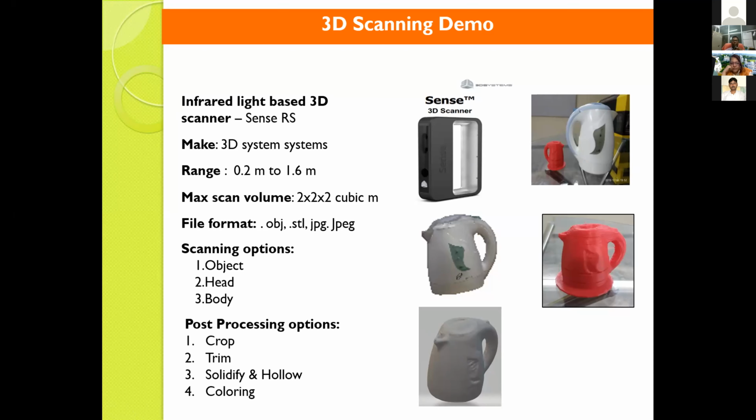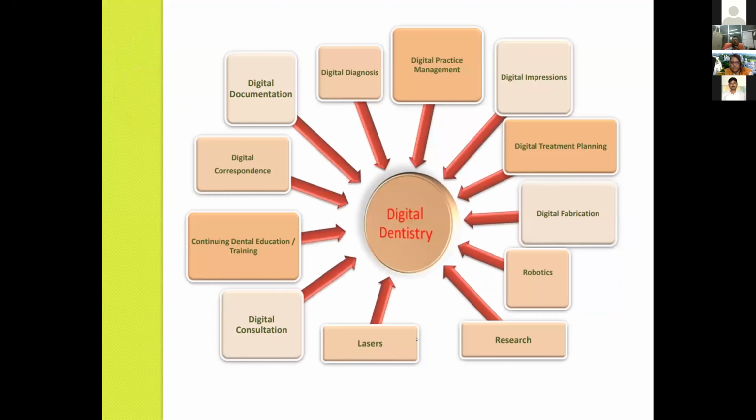When we go for manufacturing, because the actual object is not hollow, we solidify it. Sometimes we create a hollow portion, like for a crown, and for that purpose you can do it like this. My slides are not completely arranged according to the dental needs.